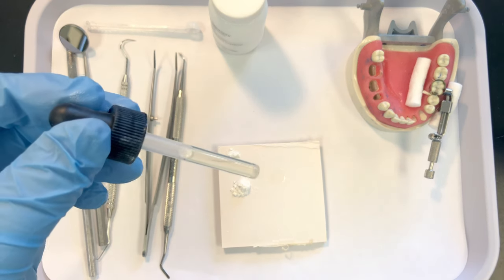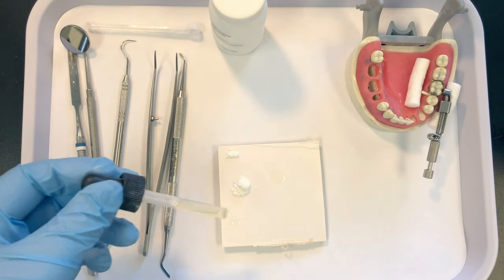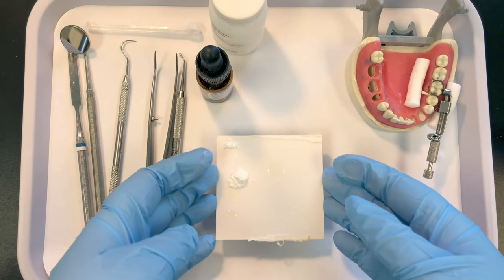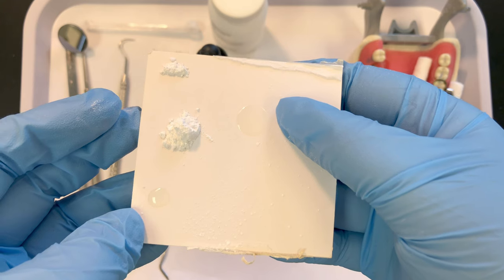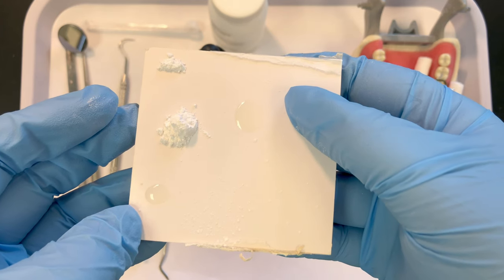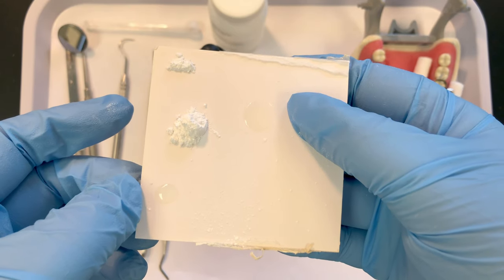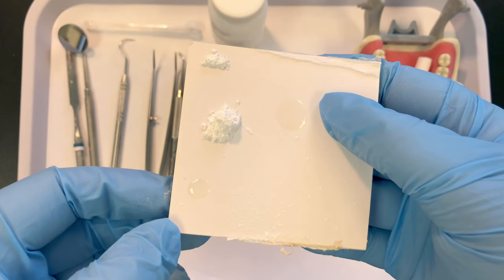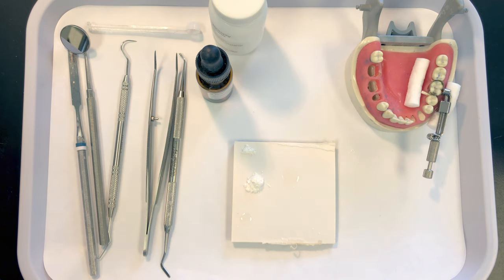Sometimes I've seen assistants hold the dropper at an angle and touch the pad — that gives you a very different size drop. Here, if I let the drop fall onto the mixing pad I get the proper dosage, but if I touch the tip to the mixing pad I get a much smaller amount of liquid. So hold it vertical and let it fall onto your mixing pad.